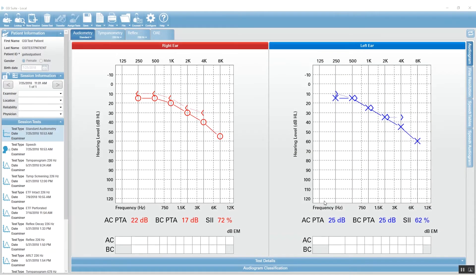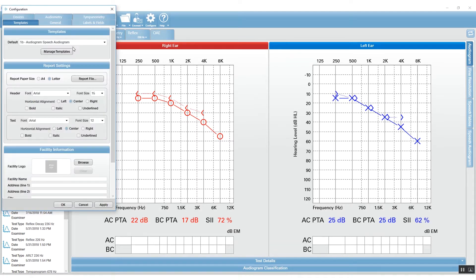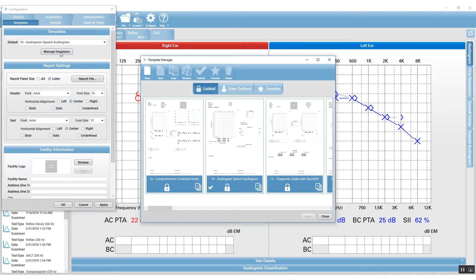GSI Suite comes with a number of different reports that are already predefined, and you just want to make a little tweak here or there. To change a report in GSI Suite, you will go to the Configure icon, and then you will go to Manage Templates.